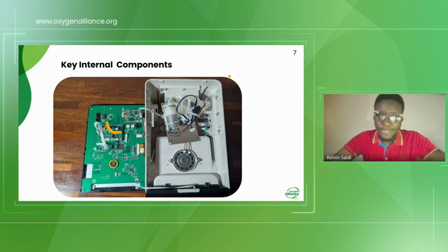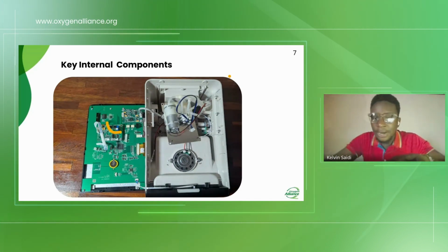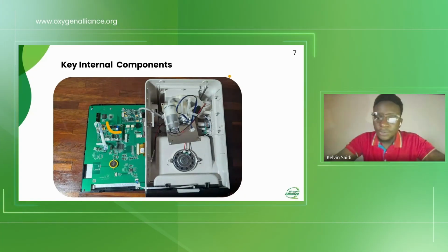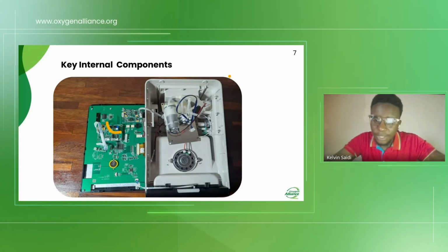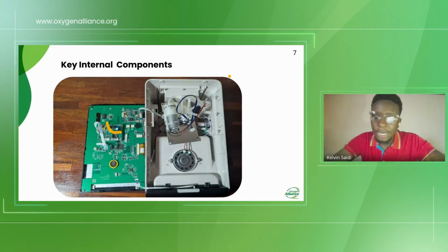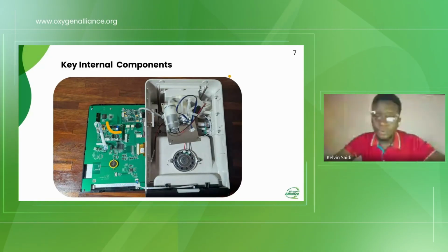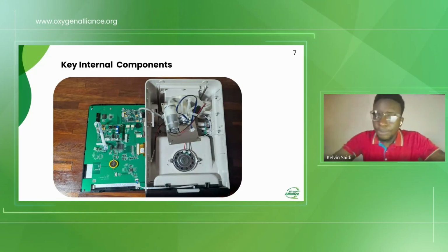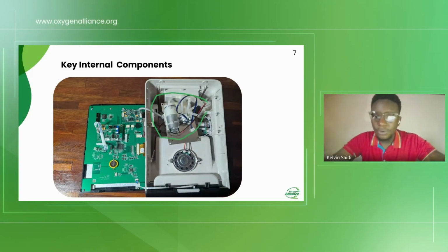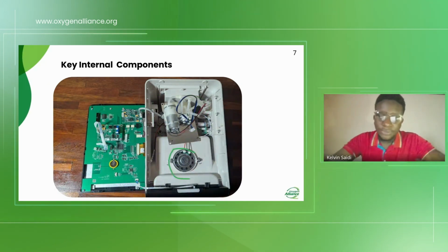Now, let us appreciate how patient monitors look internally. So this is how a patient monitor looks internally when you've just opened it up. So you can see we have the PCB that has small ports that are mounted on it. We'll talk more about that as we go on through the presentation. We have the BP pump and then the NIBP signal acquisition module. We have the speaker. So we'll talk more about this as we go on.